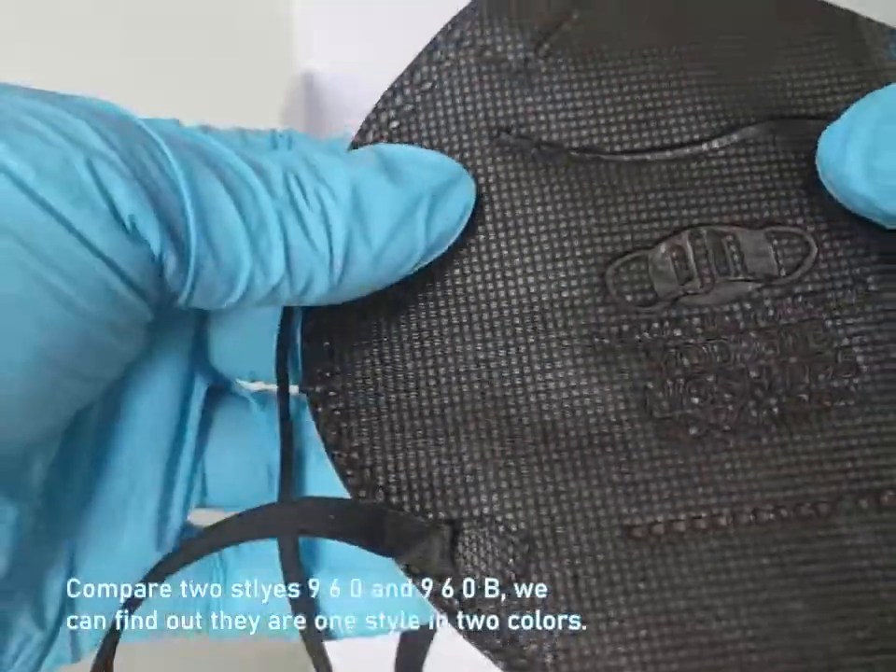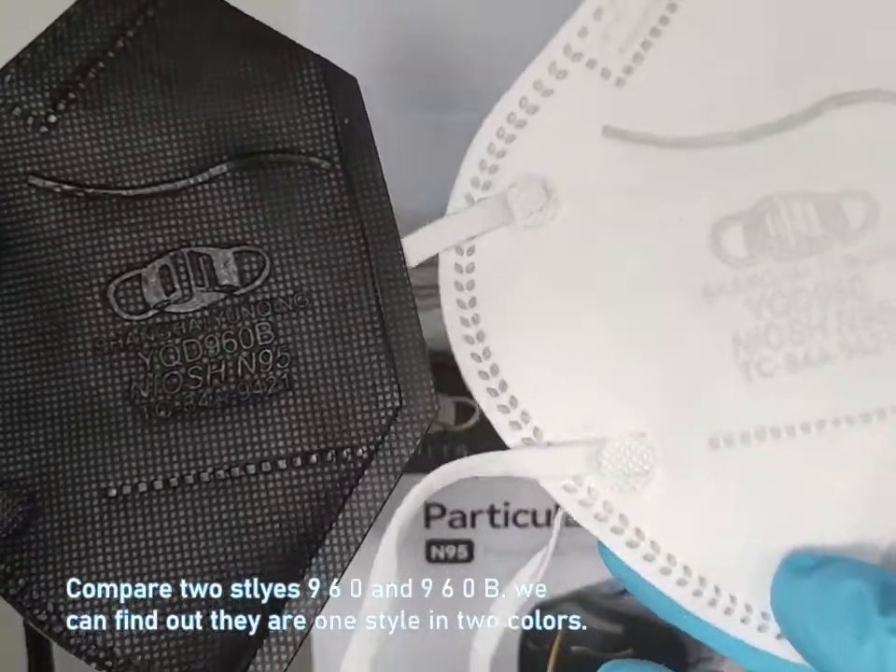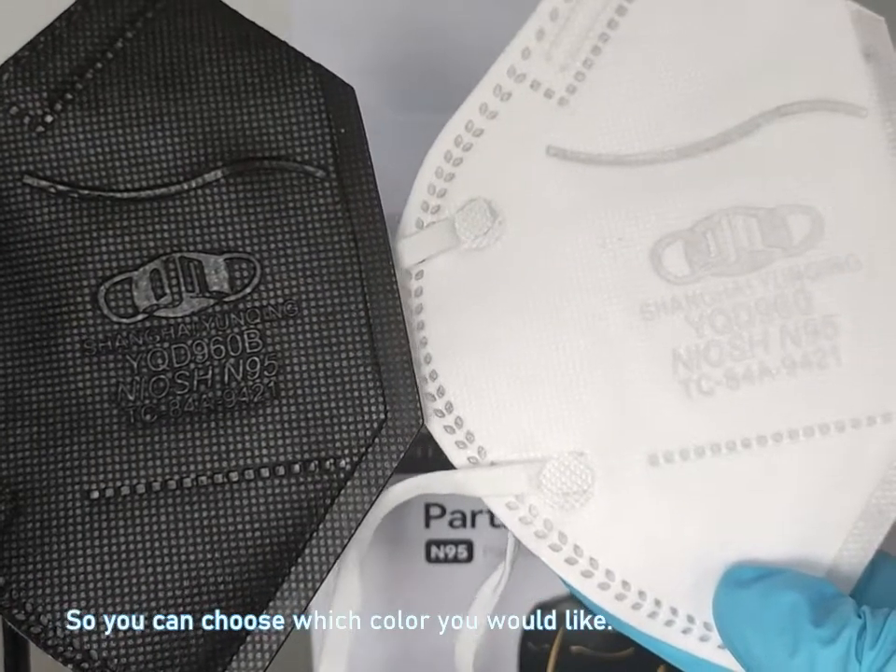Comparing the 960 and 960B, we can find out they are one style in two colors, so you can choose which color you would like.